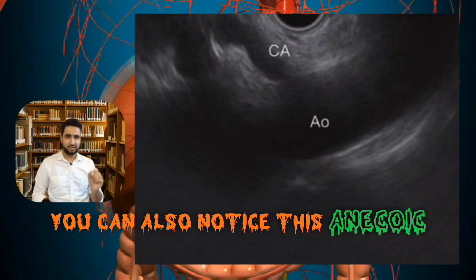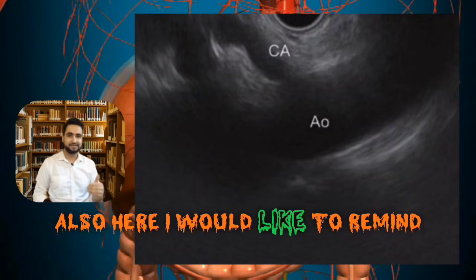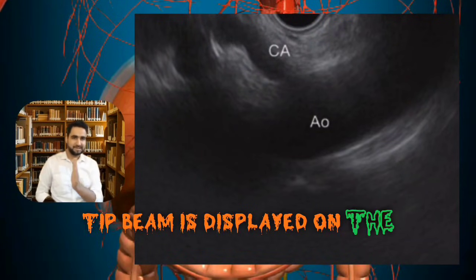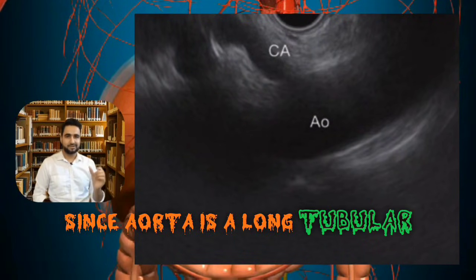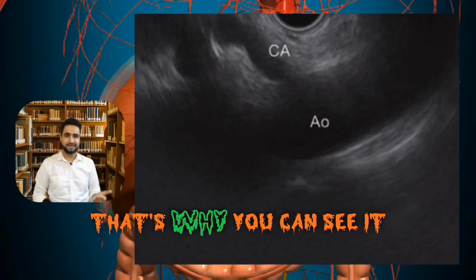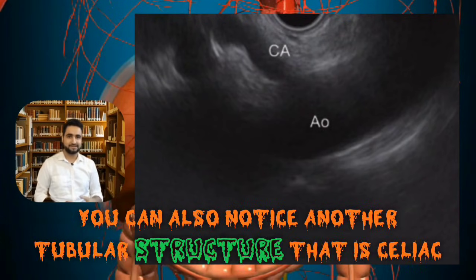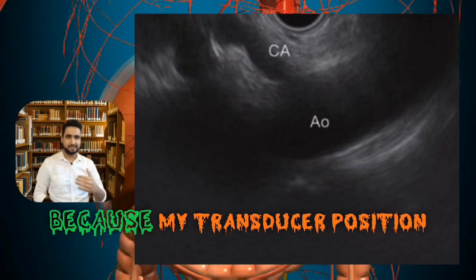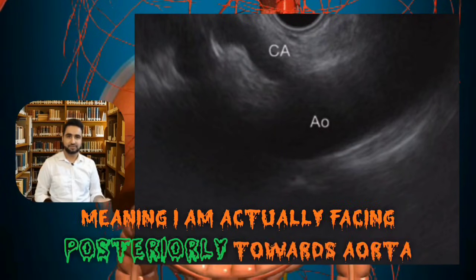The aorta extends from the right side of the screen to the center and slightly toward the left, because it is a long tubular structure coming in the range of the shaft beam, central beam, and tip beam. You can also note the celiac artery budding off from the aorta toward the transducer — that is, from posterior to anterior — because the transducer is now at 180 degrees from neutral, facing posteriorly toward the aorta.